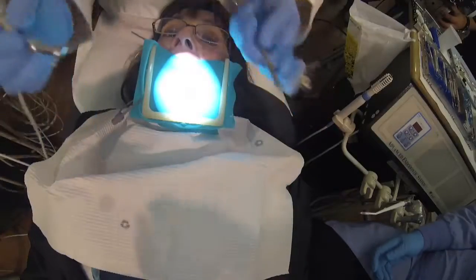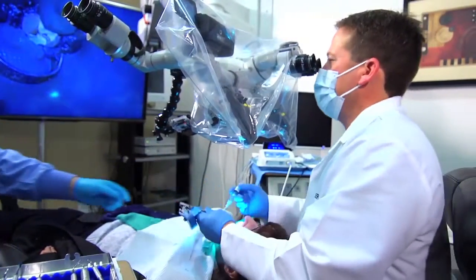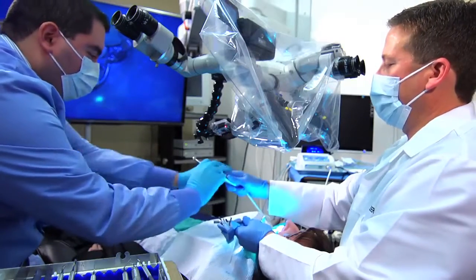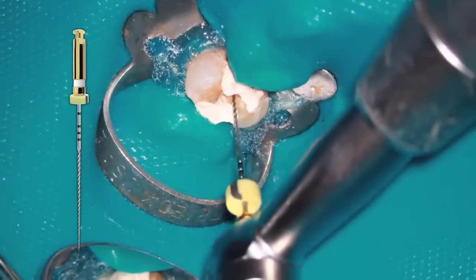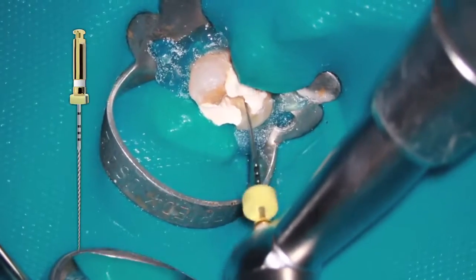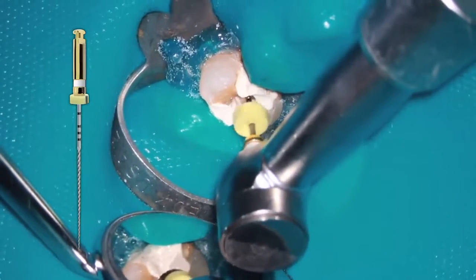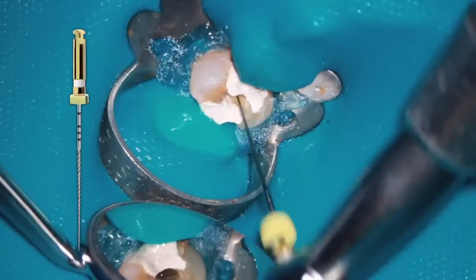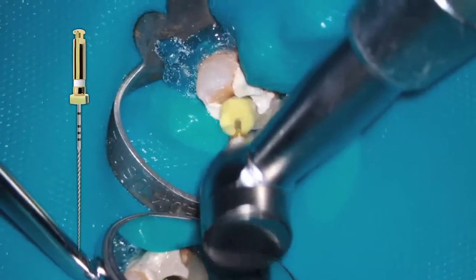So now, because I used the rotary instrument, I used the path file 13, I'm going to irrigate and endoactivate it for 5 to 10 seconds after irrigating that out. This time, a path file number 16, set at 21.5. And again, we don't want any binding prior to starting our file, so it's just going to be a 1, a 2, and of course a 3. And here we go, 1, 2, and 3, a confirmed glide path, going down the lingual aspect of our ribbon-shaped canal system.